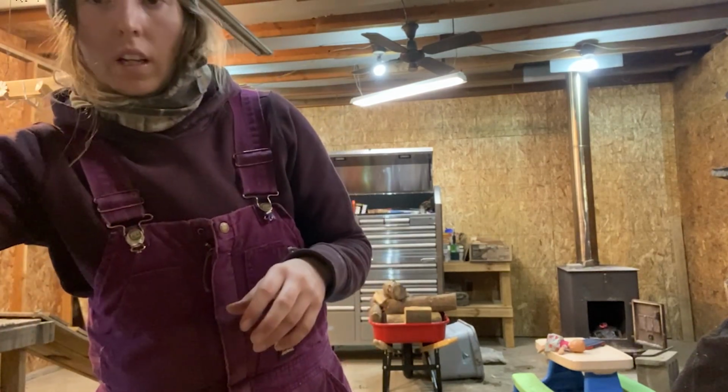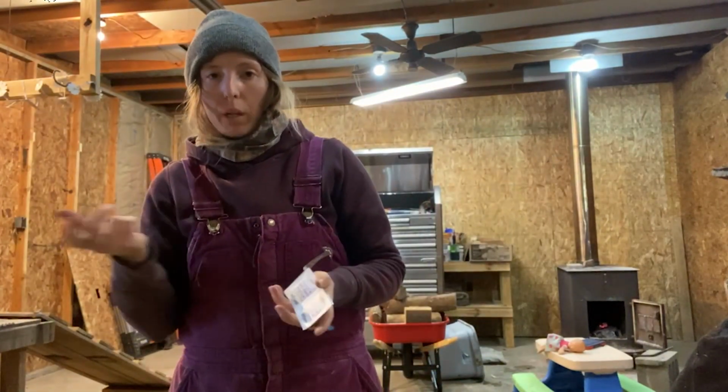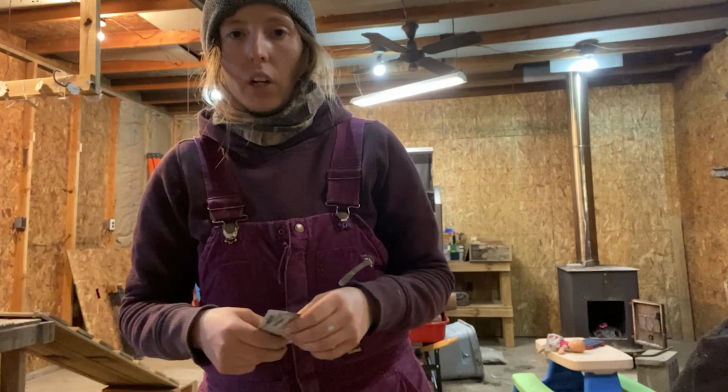And then you're also going to need alcohol prep pads, or you can buy a sprayable alcohol to clean the area. Again, we want everything to be clean and sanitary and as sterile as possible before we draw the blood. You're also going to want to clip the goats' necks, and you'll see in the footage I'm about to show you what that looks like. If you don't have clippers, it makes it a million times harder to actually see the vein. So you really need to clip their neck so that you can see that jugular vein. Again, we want to make this as pain-free, fast, and easy for both us and the animal, and the best way to do that is to clip the neck so that you can actually see that jugular.